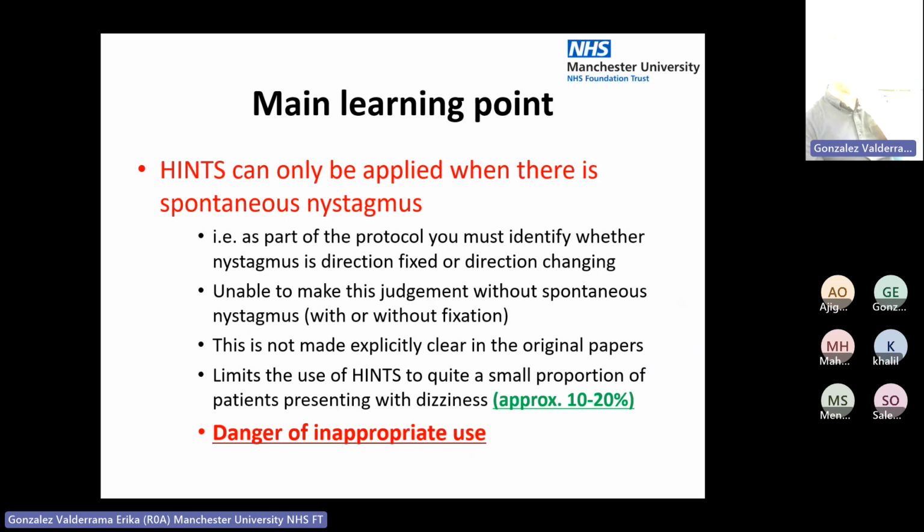So just remember, HINTS can only be applied when there is spontaneous nystagmus. If you want help looking at the nystagmus, then I can come down to the ward. We're happy to come and look, or you can video it. You can just take a video of it and show it to any of the otologists or any of those in the vestibular team in audiology. And if you fancy borrowing some Frenzel goggles or getting an ophthalmoscope out as well, that's really useful to do.